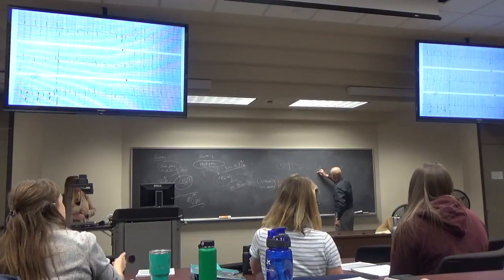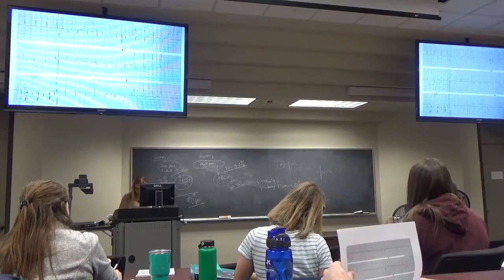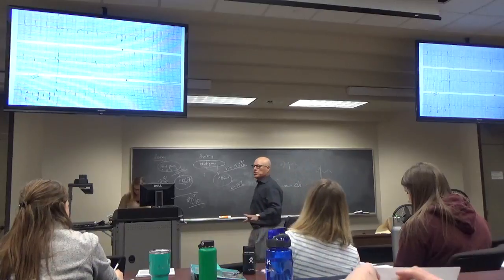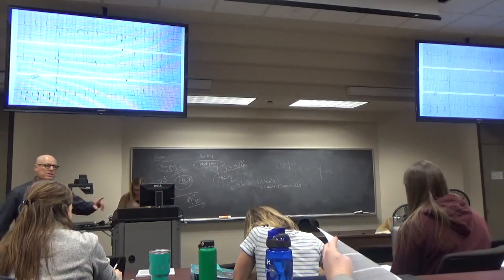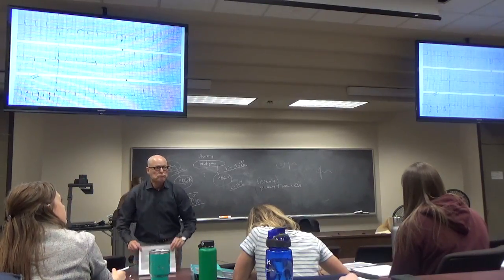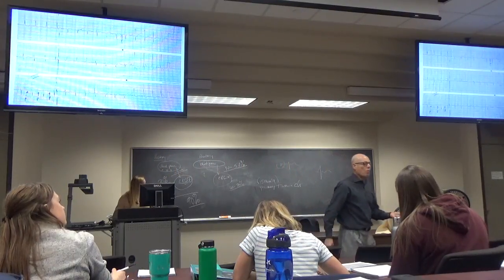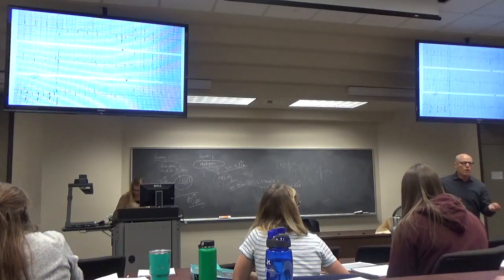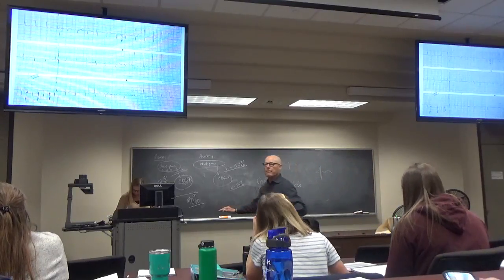If the delta wave wasn't there, that PR interval would be normal. So the delta wave is being made by this weird conduction to the ventricle. It's not going through the AV node, it's going somewhere else. We're going to see that a little bit later. What do you have if the PR interval is too long, greater than 0.20? First degree AV block. What do you have if the PR interval is too short? I mean, these are just rules. It's there every time. Okay?